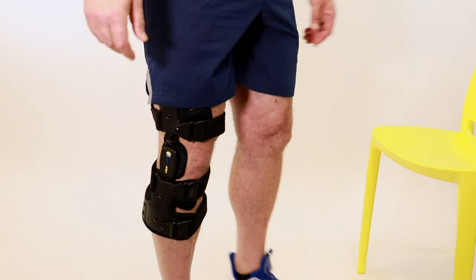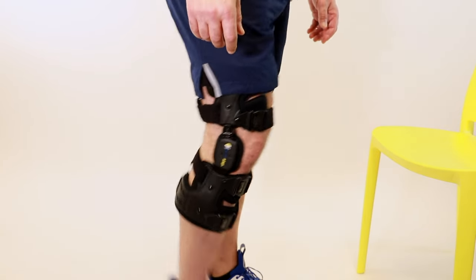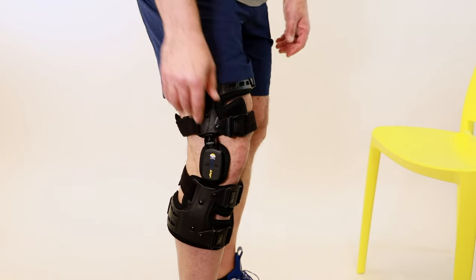To check for proper fit, stand up and walk or move around, noticing if there are any pressure points. If there are pressure points, further adjustments may need to be made, or you may need to call BraceDirect to get fitting help.